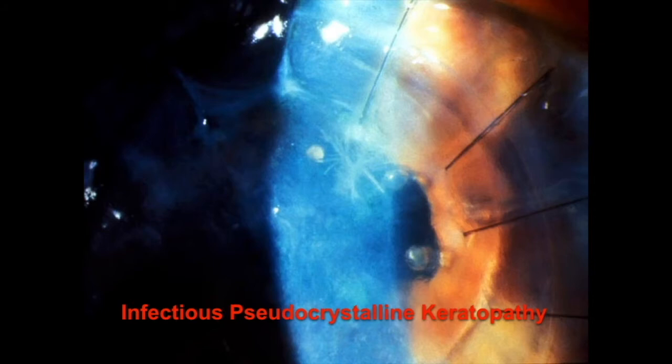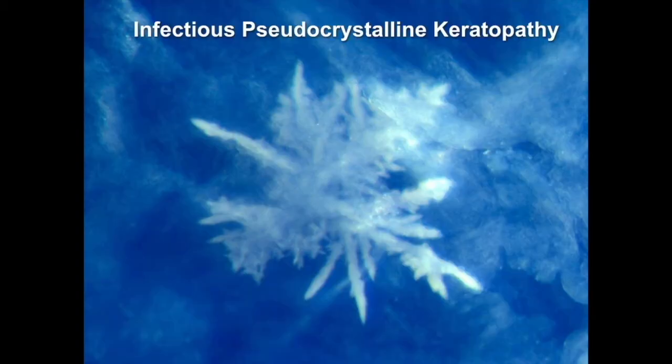Infectious crystalline keratopathy can occur in patients who have been on chronic steroid therapy for a potential graft rejection, as occurred in this patient. Here is this crystalline-like deposit shown under higher magnification in the pathology specimen.